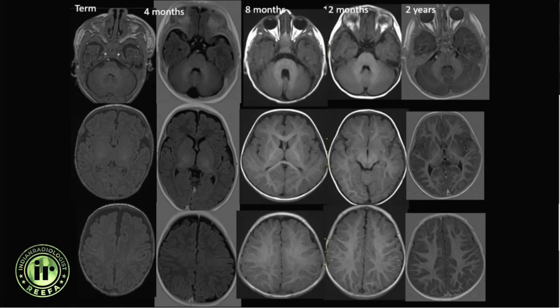By four months, myelination is seen in the anterior limbs of the internal capsule and in the splenium of the corpus callosum. By eight months, myelination has progressed to the subcortical white matter of the parietal and occipital regions and is also extending into the frontal lobe, progressing in a posterior-to-anterior gradient.